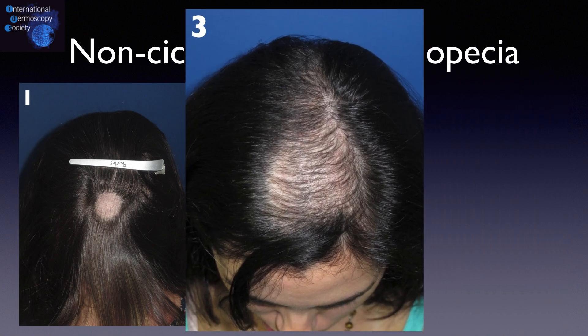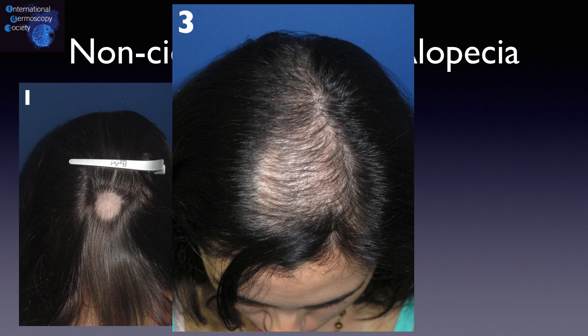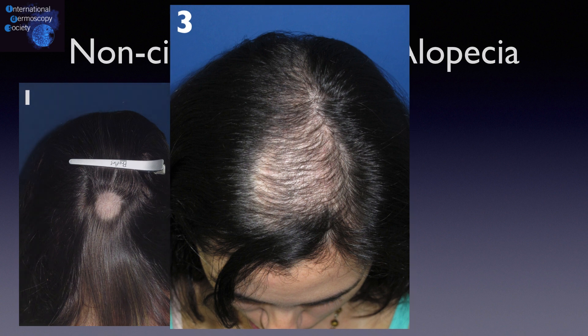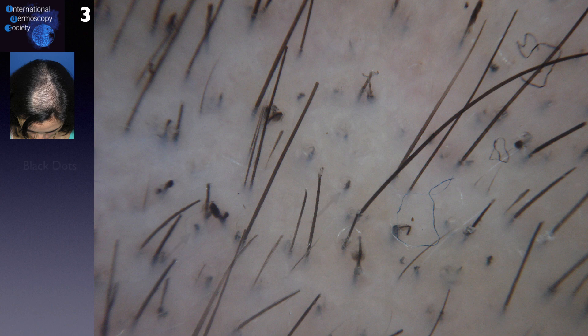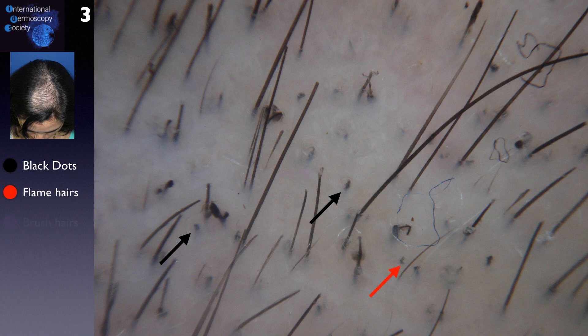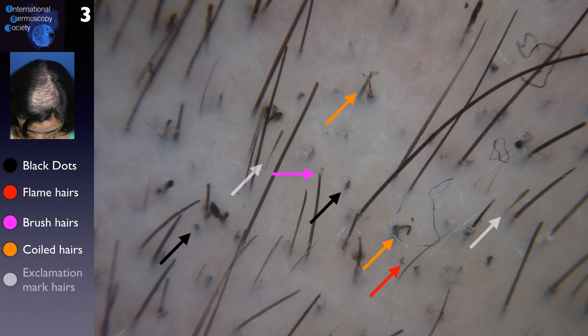The third case is an irregular patch alopecia in the central area of the scalp. From trichoscopy, numerous types of broken hairs at different heights are noticed. We can see black dots, flaming hairs, brushed hairs, and coiled hairs. In addition, there are some exclamation mark hairs in the middle of the scales.